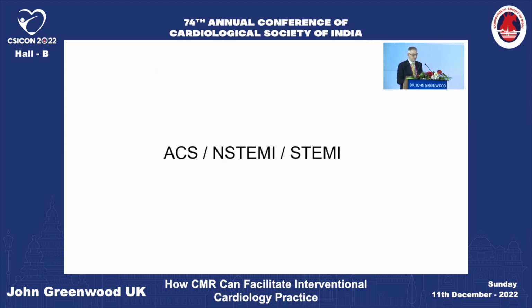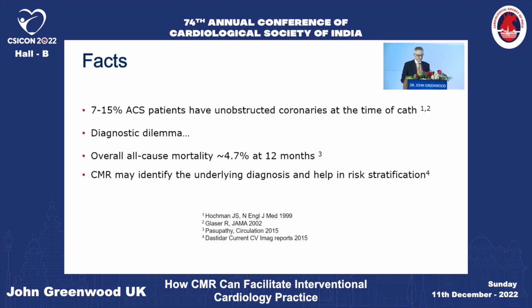So let's just turn now to the last of the scenarios that I just wanted to try and cover. So we're going to look at acute coronary syndromes. We already use CMR extensively in stable coronary disease, but this is a real growth area, I think, in the UK, because NSTEMI, as you know, is quite a heterogeneous condition.